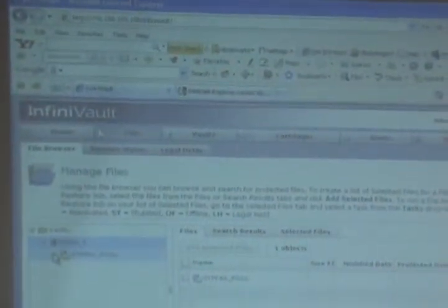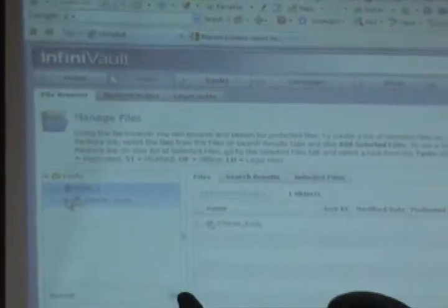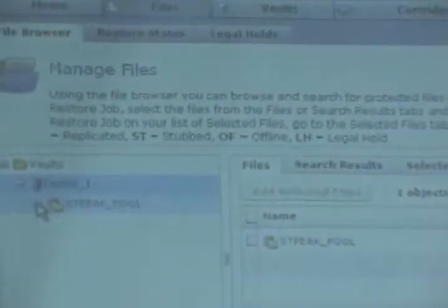Again, usually when I set up viewers, you don't use port 104 in both directions. So I'm wondering if that's the problem. I don't think so. There's a port that the InfiniVault has to talk to on your server, and it's the same port number on a different IP address, and that's okay. Maybe something else is going on. Is there any sort of alarm at all?